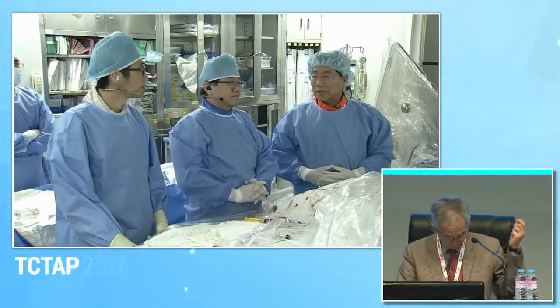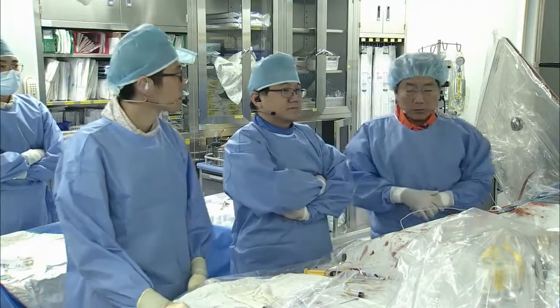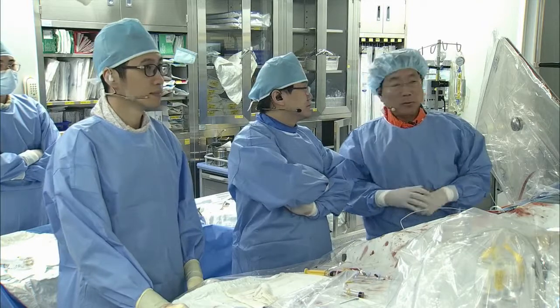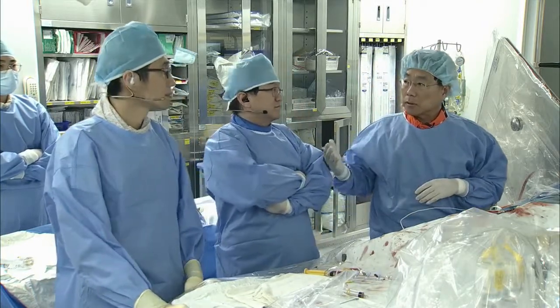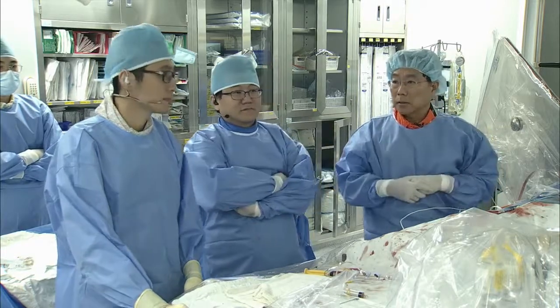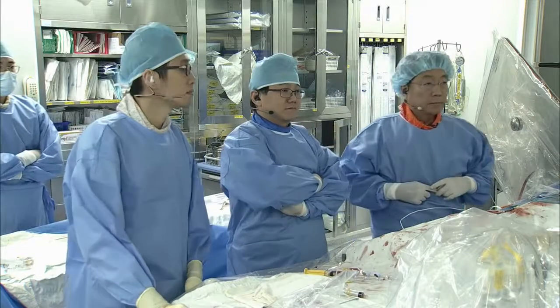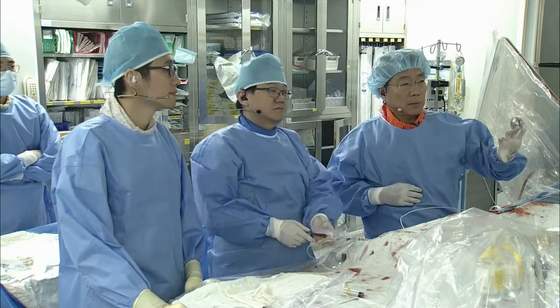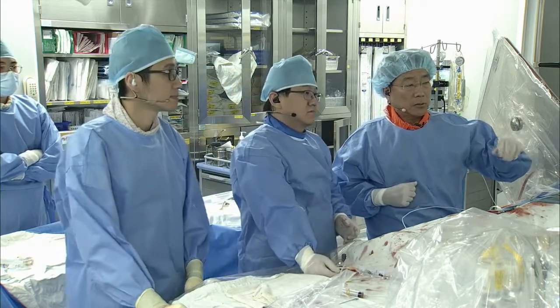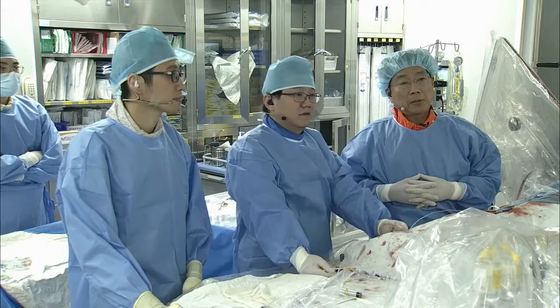Okay. This is the last session, with the last cases from the Asan Medical Center. As usual, I'd like to do the last cases with our family: Dr. An, Dr. Lee, and Dr. Bach, he's coming. This is a little bit complex bifurcation disease, so we're going to introduce from the patient history first.